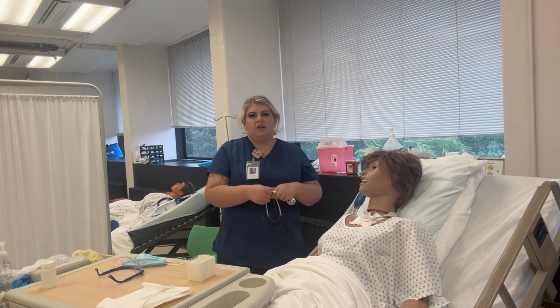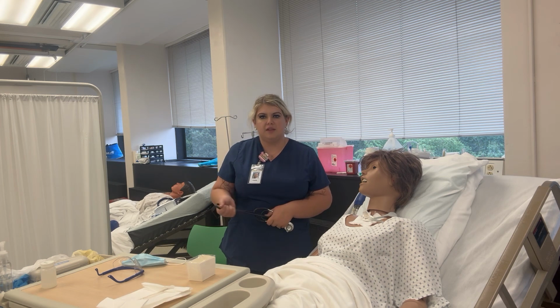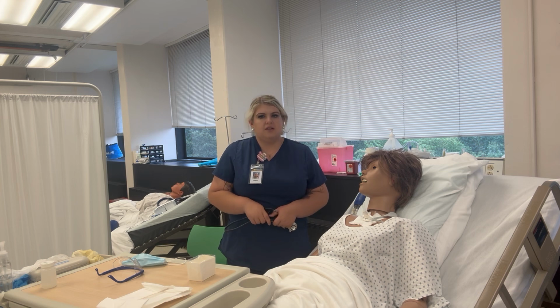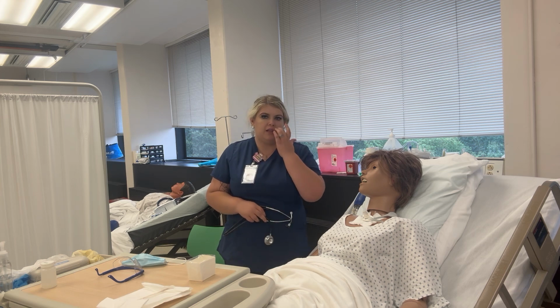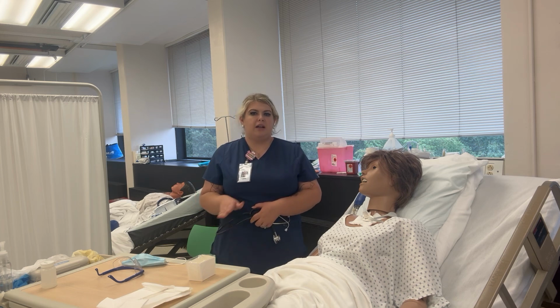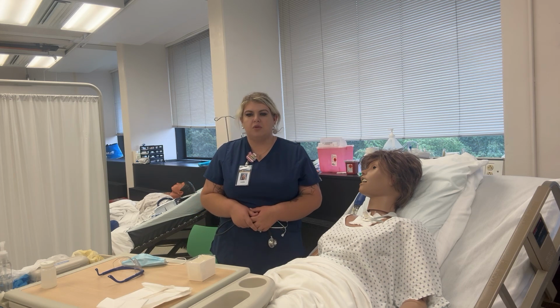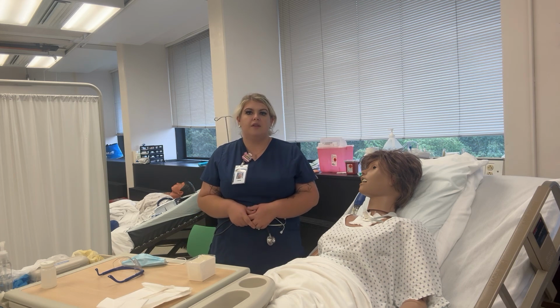So based off of the assessment, the patient doesn't sound near as congested. So I think that doing the suctioning was a success. Patient is not in any discomfort or any pain at this time. We're going to go ahead and lower the bed back down to a safety level. We're going to give the patient the call light, make sure that they are comfortable, remove all of the supplies we used in the room, and we're going to document and report.